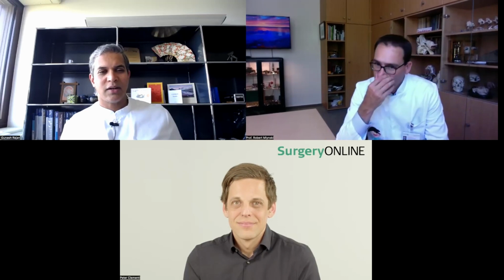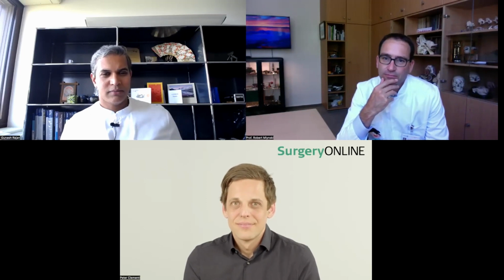Arno Dietz is very experienced in doing cochlear implantations in the elderly under local anesthetic, and he is having very good results. So I think that's very doable as well, especially considering the elderly. I was thinking about implanting elderly patients and the effects of anesthesia on their cognition. I think there's an increasing amount of evidence that there is an impact. So maybe really reconsider the local anesthetic technique.